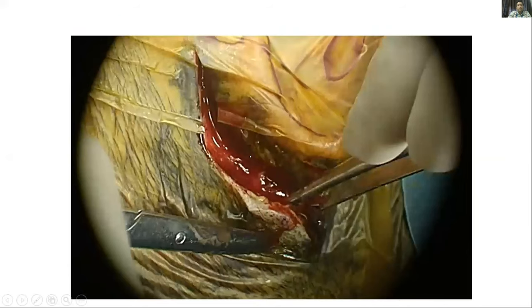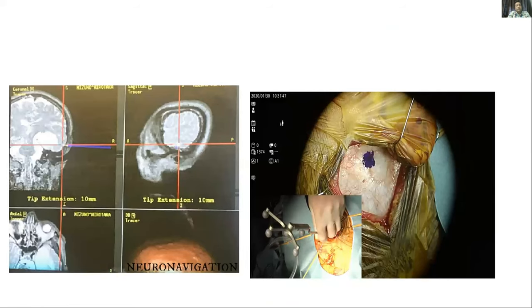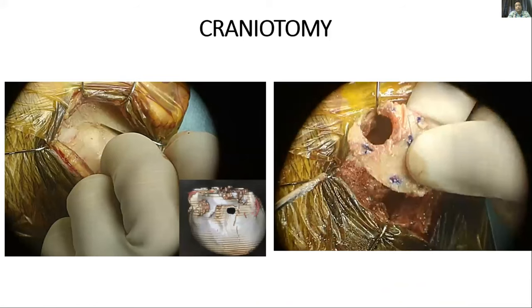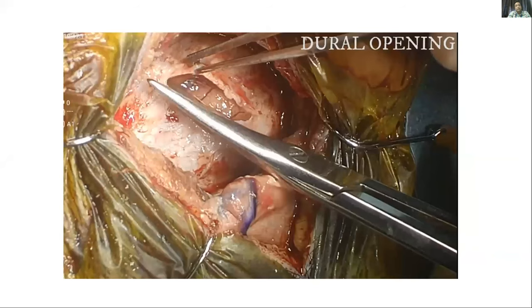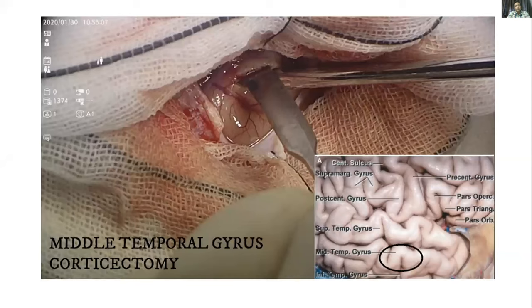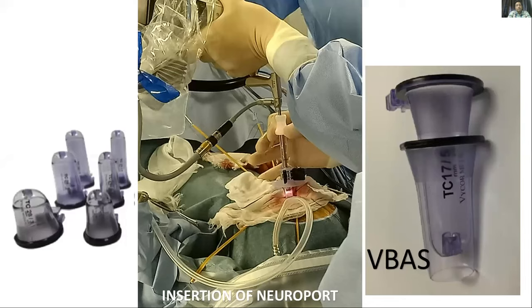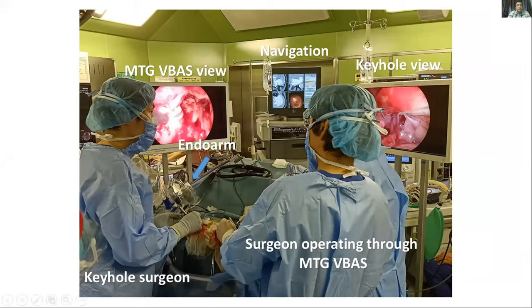Simultaneously, another neurosurgeon team was operating through the temporal side. A curvilinear incision was made in front of the tragus going superiorly and posteriorly over the temporal area. The temporal fascia was dissected and, with navigation guidance, a craniotomy of approximately 2.5 x 3 cm was made. The dura was opened over the middle temporal gyrus in curvilinear fashion and a corticotomy of approximately 1.5 cm was made. The ViewSide brain access system was inserted, with two sets of neurosurgeons operating simultaneously — one through the keyhole and another through the middle temporal gyrus.